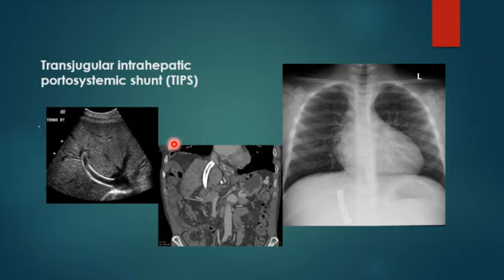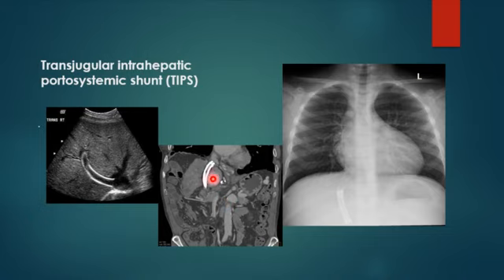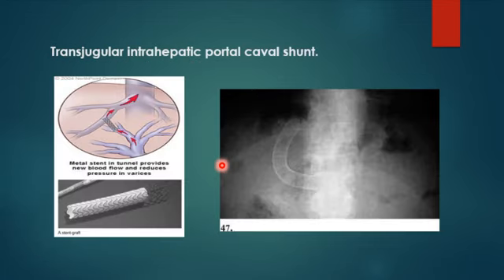TIPS — transjugular intrahepatic portosystemic shunt — consists of two radiopaque lines creating a direct communication between the hepatic vein and branches of the portal vein, bypassing the liver. It is used as a treatment for portal hypertension. You will always see it in a cirrhotic liver with portal hypertension. On X-ray and CT the stent is visible extending from the portal vein into the hepatic vein toward the vena cava.